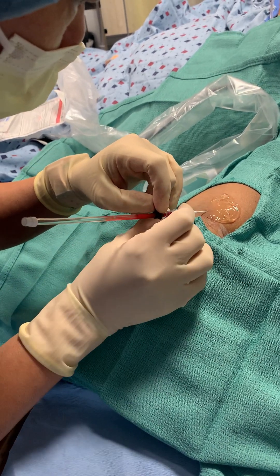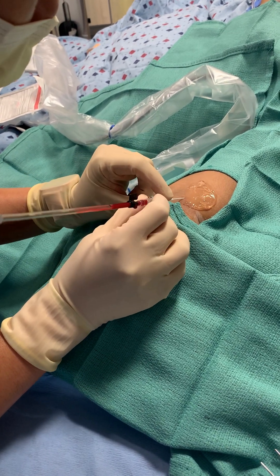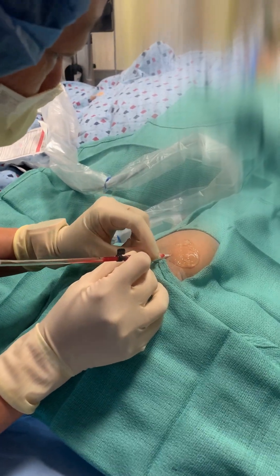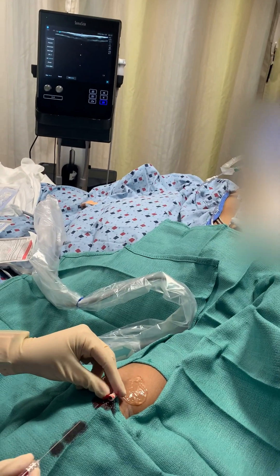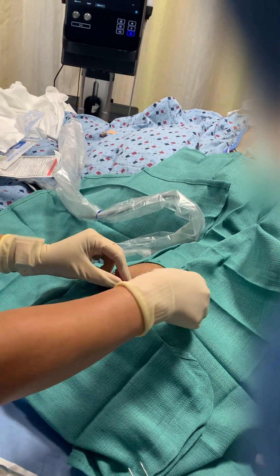Very slowly, I'm just going to push it in. Hopefully we're not going to have any resistance. The guide wire is inside, and you're going to push the catheter in through the guide wire. You will see blood is red — that's how you know it's an artery. It's also pulsating, you can see it's pulsating. Now we know we're inside the artery.